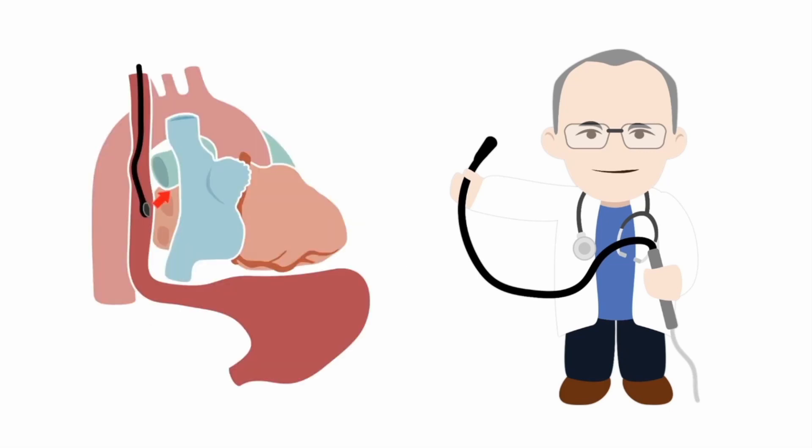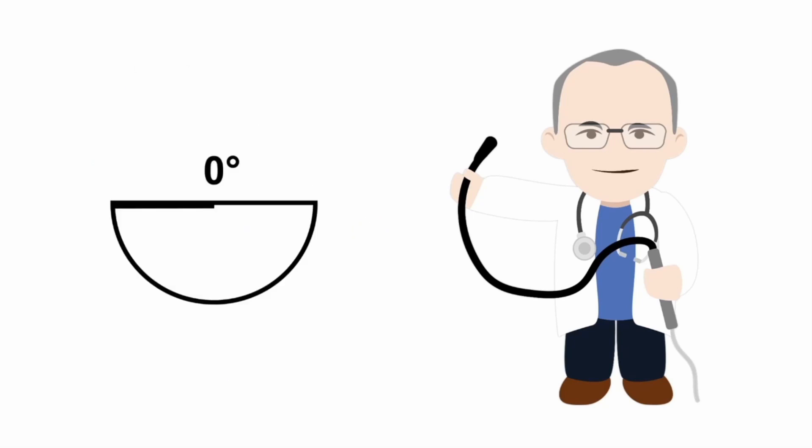This view is obtained at the mid-esophageal probe position, with the probe facing anteriorly, to obtain a cut through the left ventricle. I'd suggest starting with a transducer imaging plane angle of zero degrees; however, some fine-tuning is needed to obtain an on-axis four-chamber view, and I'll show you exactly how to obtain that.